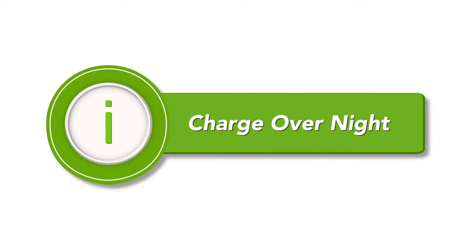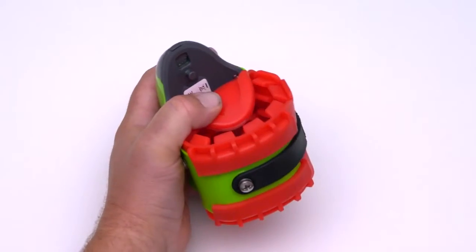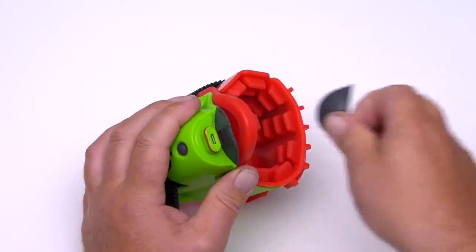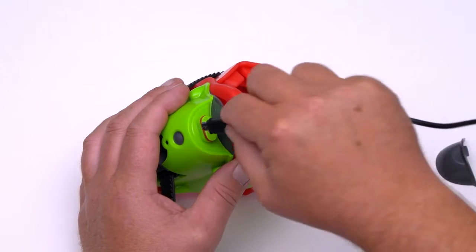You will need to charge your MUCOL calving sensor before use. Peel back the red rubber lining. Remove the waterproof charge cap using a flathead screwdriver. With the correct orientation, insert the charge cable into the USB port.